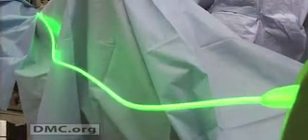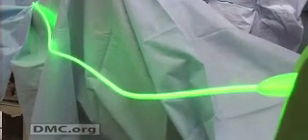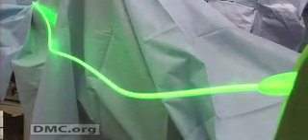Dr. Jones and others facing this surgery don't have to worry about those circumstances. We're able to use a smaller metal telescope and a little laser fiber that goes through it, and the laser fiber has a visible light that you can see. The laser itself is invisible, actually. And wherever that light shines on the prostate disappears, it vaporizes. And in most cases, there is absolutely no bleeding whatsoever. In a significant percentage of the cases, they don't even need to have a catheter inside them. They can just leave the operating room and go urinate normally.